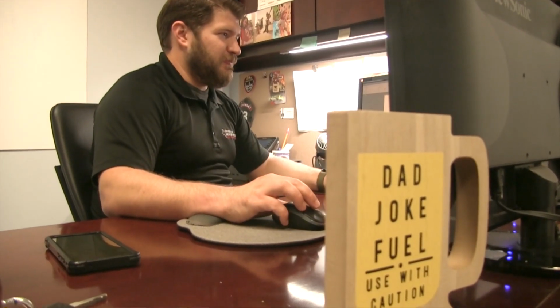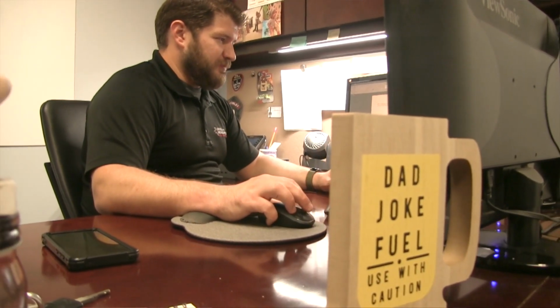Now, when we review these cases, you'd be amazed at how often a supraglottic surprises us with its ability to rescue a bad situation. If the supraglottic is working, that's a win for us, and more importantly, it's a win for the patient. It can buy the patient the time they need to safely get to an emergency department that has more resources, more airway expertise, and more airway tools.